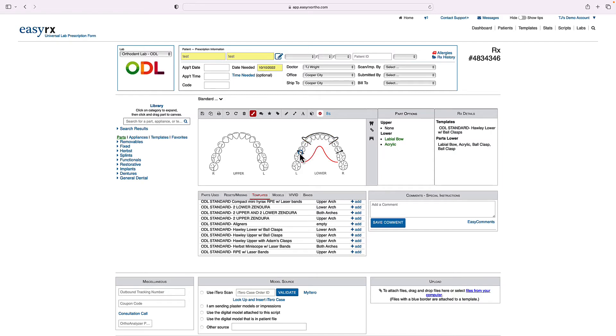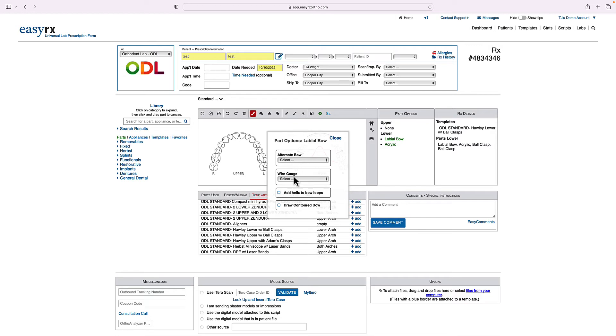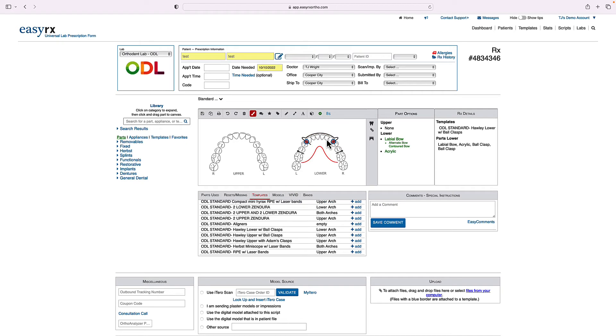Now, this part has no part options. It's just a blue circle with nothing inside of it. Now, if I click this bow, you'll notice I've got a blue circle with a red gear inside. Now, what that red gear means is that this part has a part option. And if I right click that gear, I can adjust it. So I can change to maybe a contoured labial bow and then hit close. So if you get a red gear there, that means there's part options and you can right click and move it.